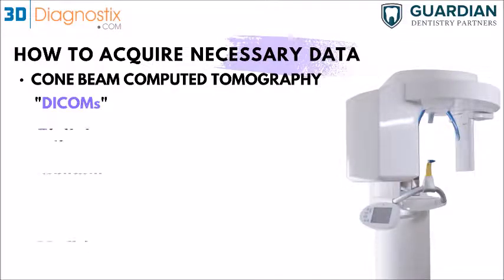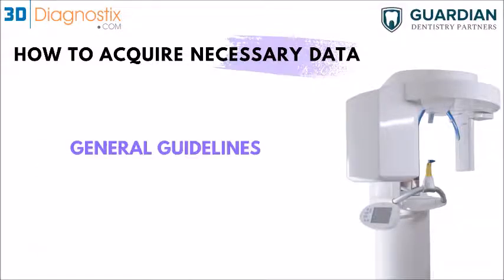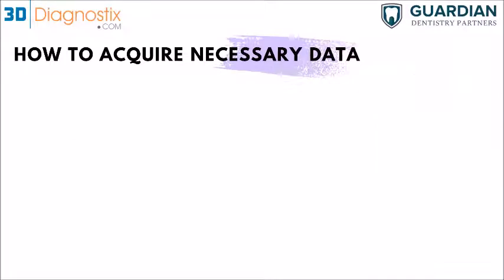So this is just the first record, the cone beam CT scan DICOMs, and send us those DICOMs. And we have some recommendations when you scan the patient, whether the patient is edentulous or has dentition.